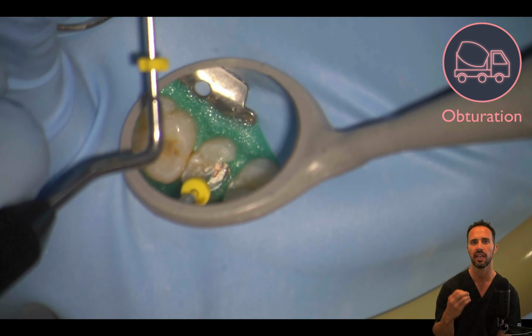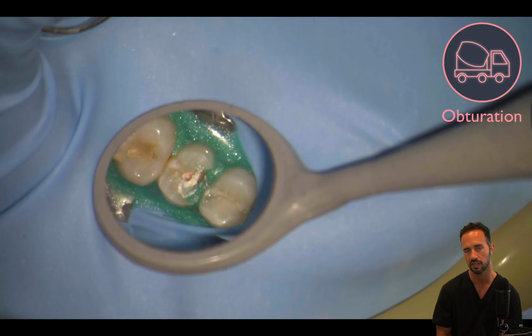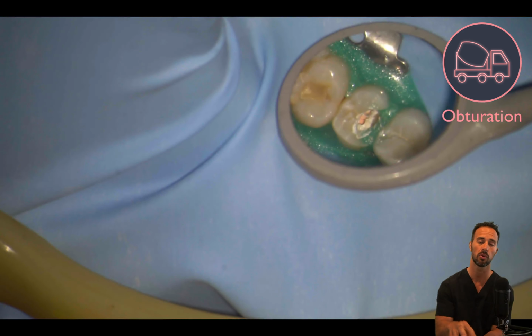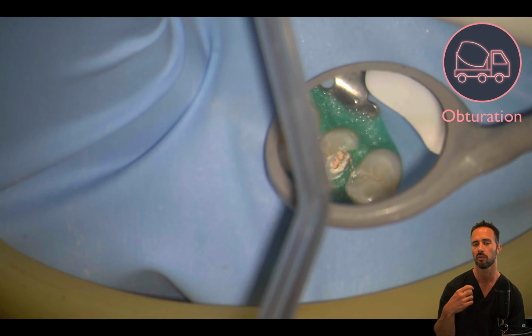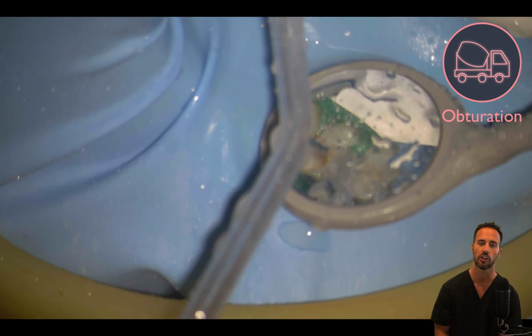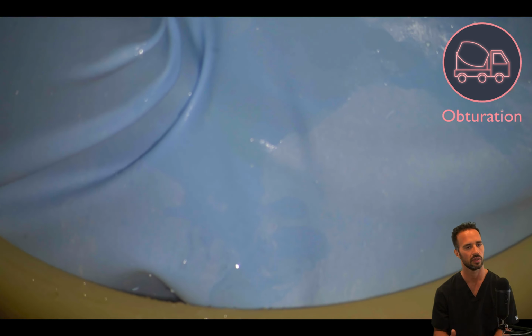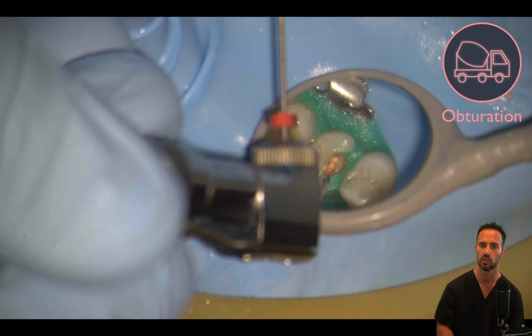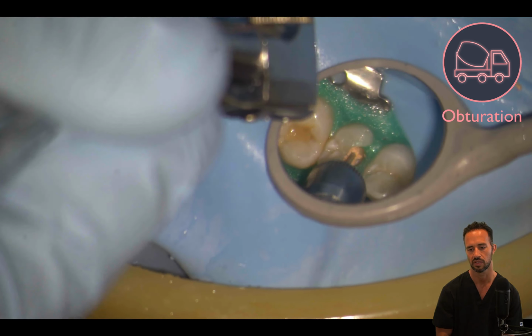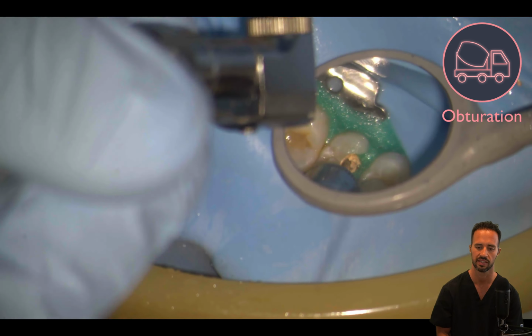Alternatively, you can simply use a Gates Glidden. I use a size 4 Gates for most cases to prepare that post space. That's going to give you a little bit more predictability in terms of the chance of you pulling out your gutta percha cone. And if that makes you feel more comfortable, by all means, go ahead and do that. Okay? You probably are used to using that as opposed to the System B tip. But if you want to use the System B, that's nice because you don't remove any dentin at that point. All right? But I do both. I use the Gates Glidden oftentimes in order to just clean out that post space and make sure that it's a nice, neat area.